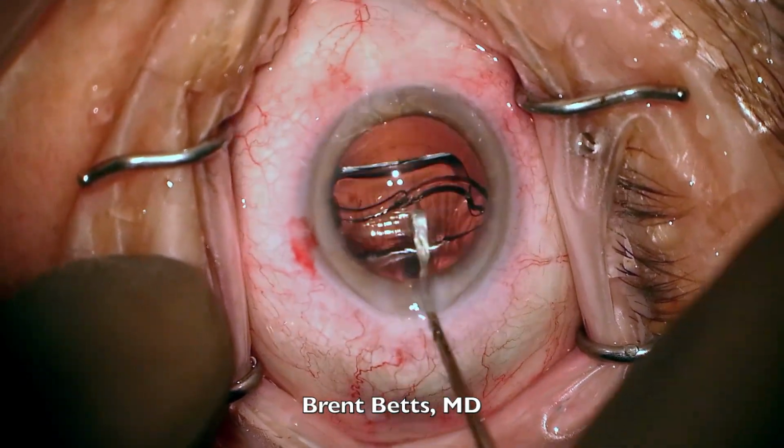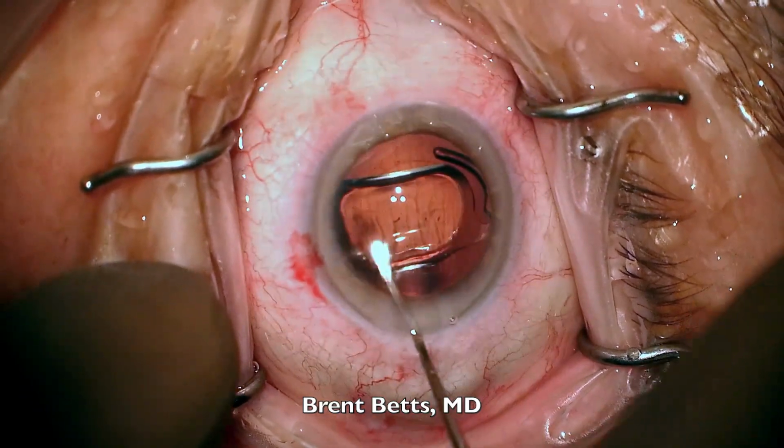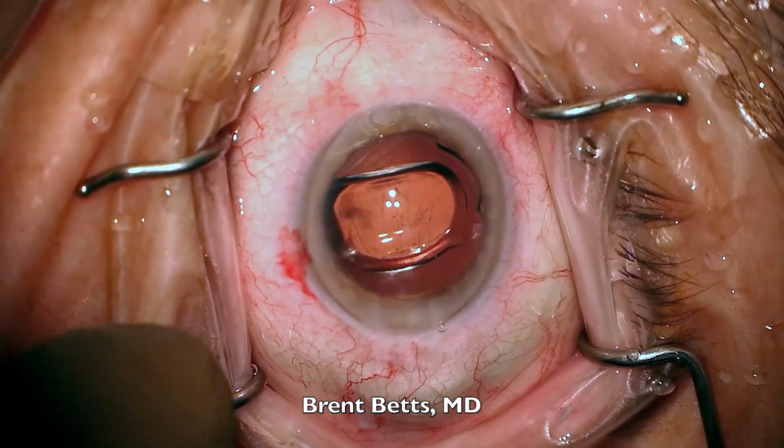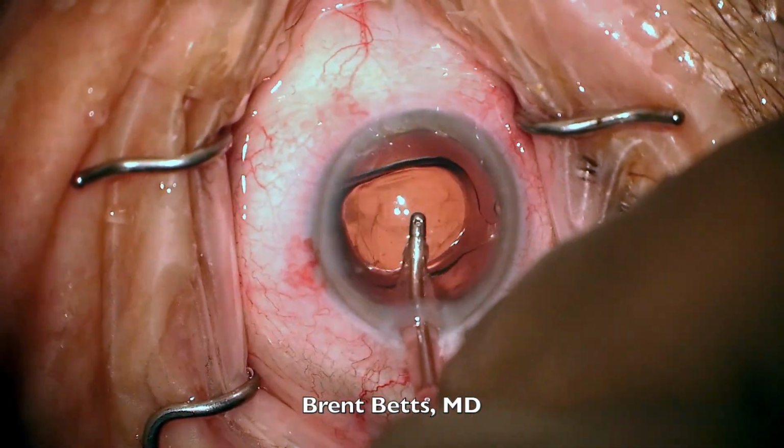You can see the little arms of the lens are stuck together, and I gently lift up on those to break the adhesions. And then the lens kind of folds out into the orientation it wants to be in.